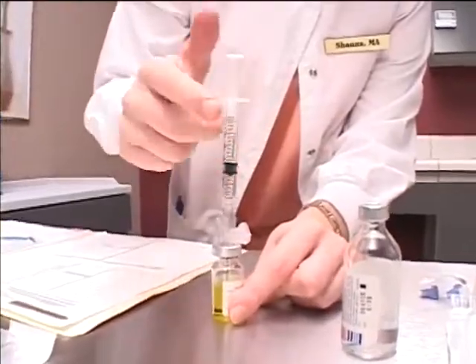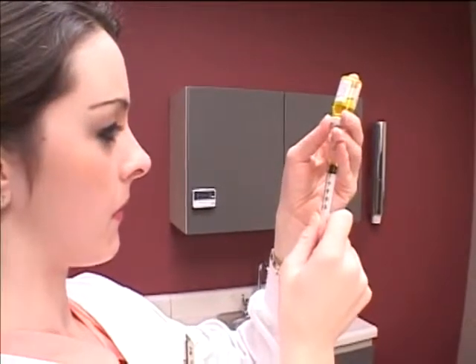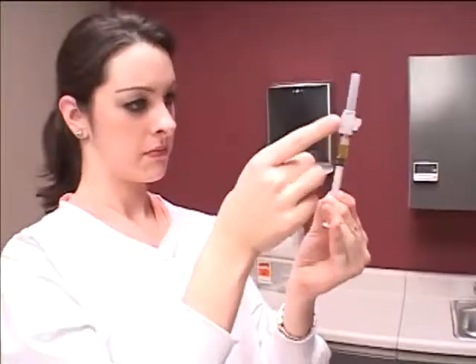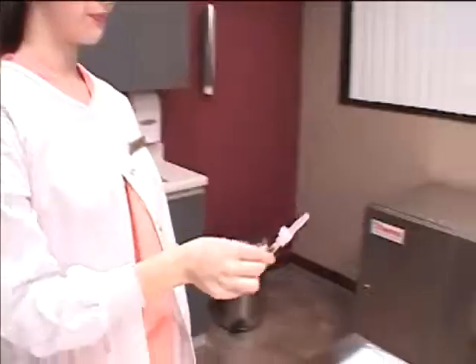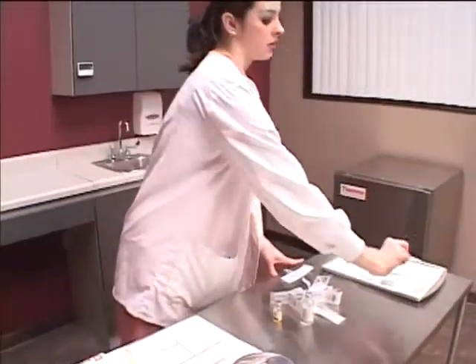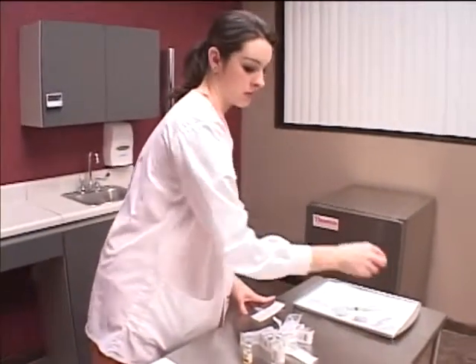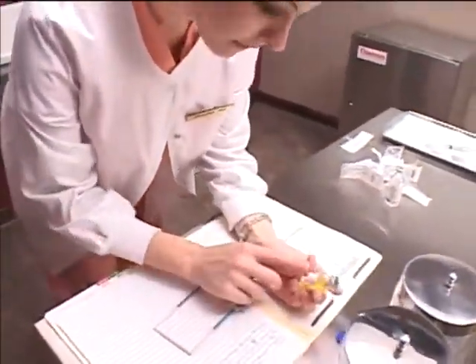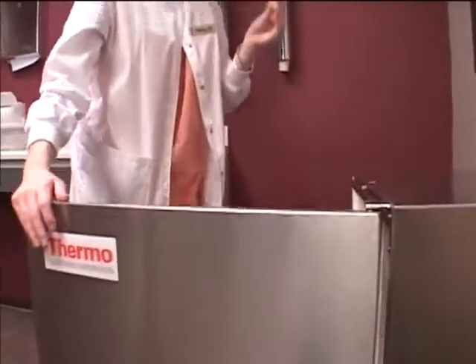Withdraw the desired amount of medication using the technique demonstrated previously. Recap the needle and flick the syringe to remove any air bubbles and place the syringe, cotton balls, alcohol pad, and adhesive bandage onto a medication tray. Check the medication against the physician's order before returning it to the appropriate storage area.